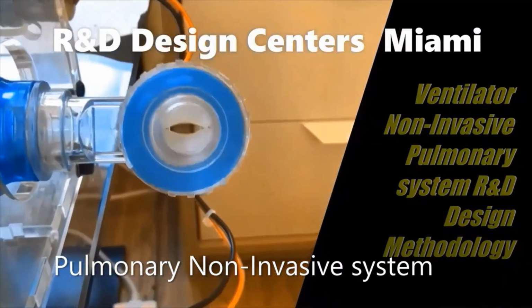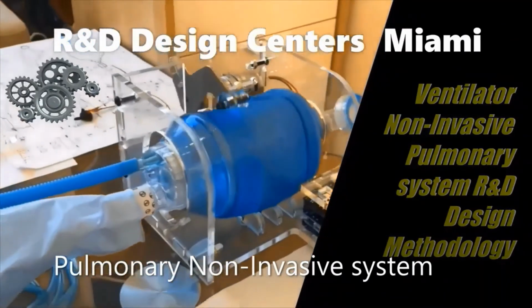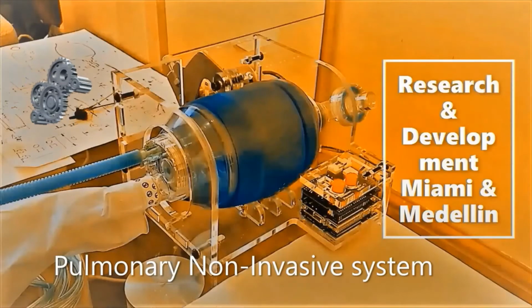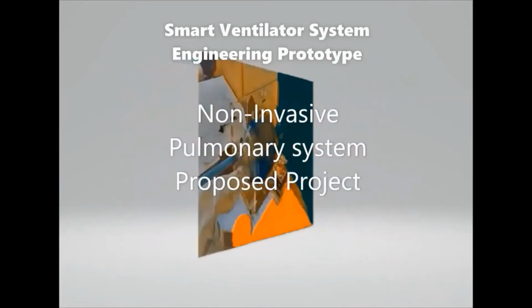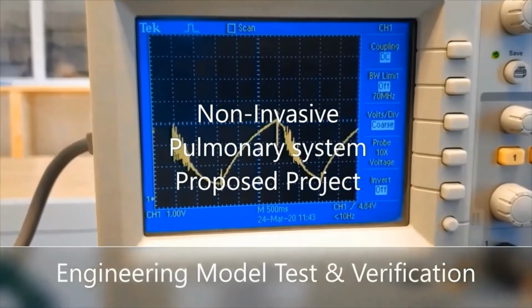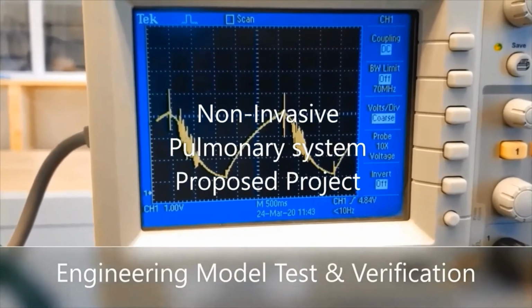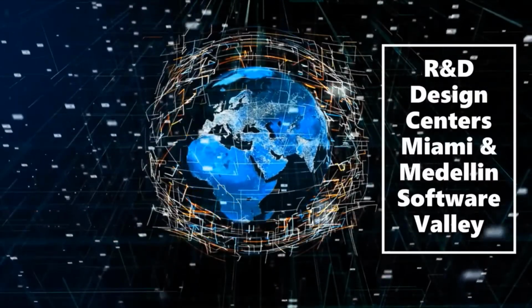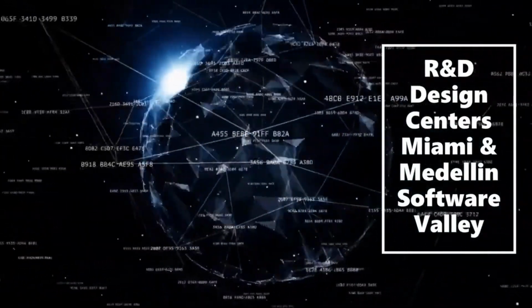This is the mandatory breath. At this point, the patient must be heavily sedated. The machine needs to trigger the breath cycles and end the breath cycle as well. The embedded CPU will detect and control the breath trigger and timing. There are a multitude of other design parameters and considerations that need to be taken into perspective.